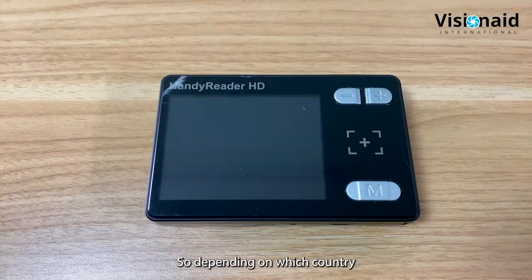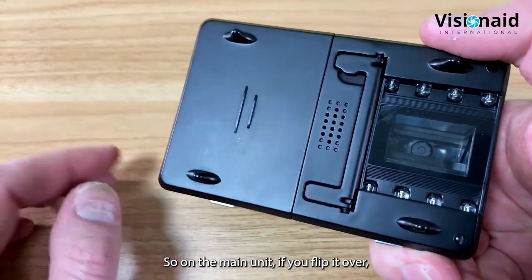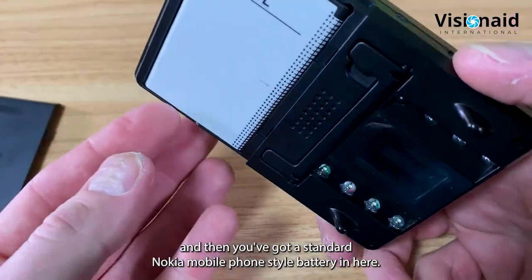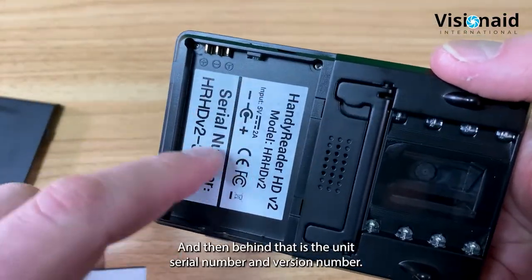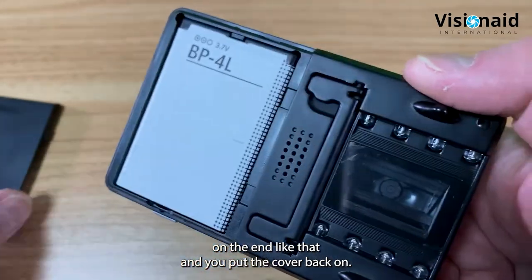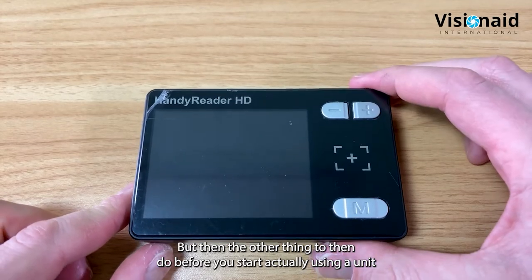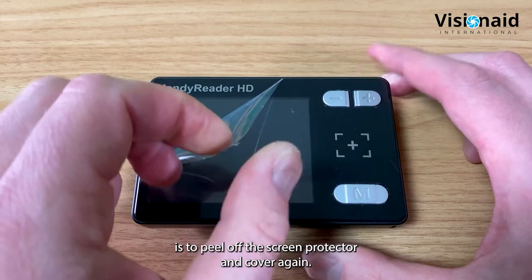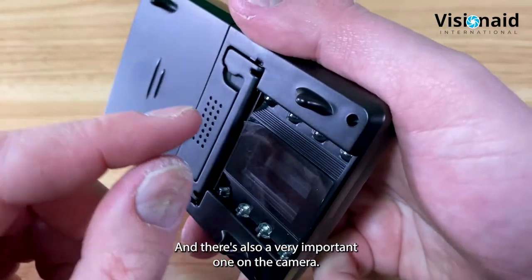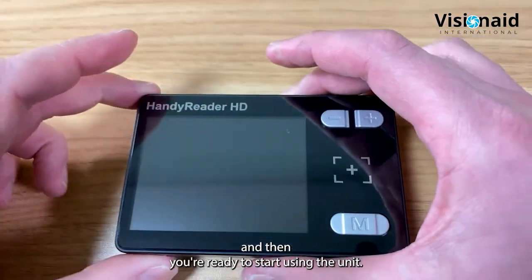You also get a nice padded carry pouch for protection. Depending on your country, you may need to install the battery yourself - flip the unit over, slide open the grippy back panel, and there's a standard Nokia mobile phone style battery. The serial number and version number are behind that. Also peel off the screen protection cover and, very importantly, the camera protection cover - without removing that one the image won't be clear.